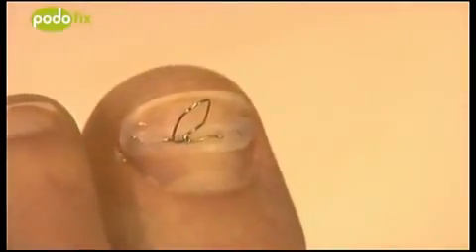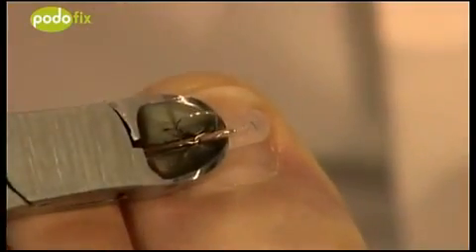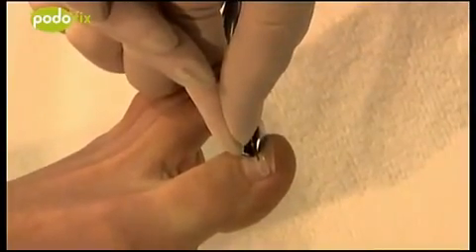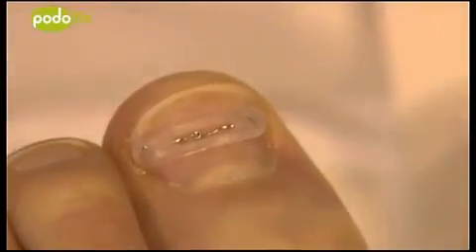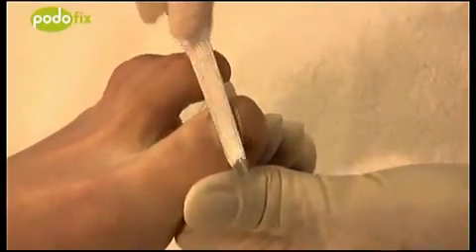Use the side cutter to cut the wire loop. To do this, lay the cutter flat on the brace and cut the wire loop with a cut parallel to the loop. Now use a nail file to smooth off the wire ends.